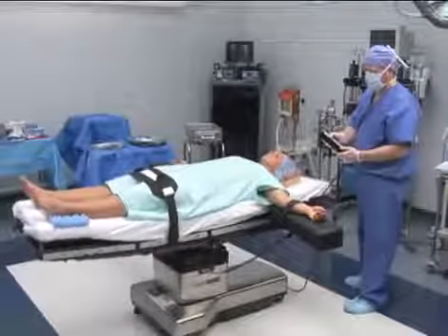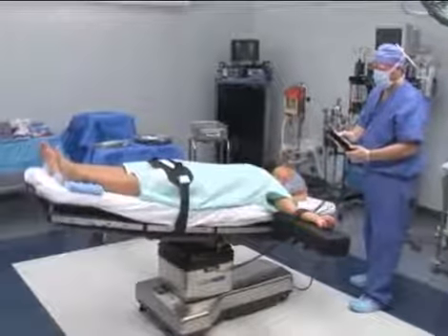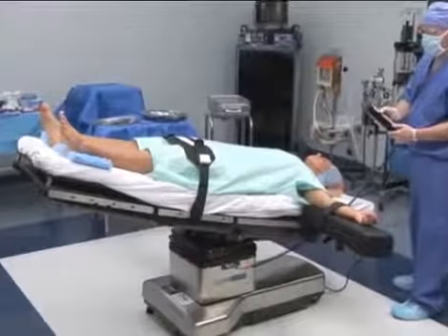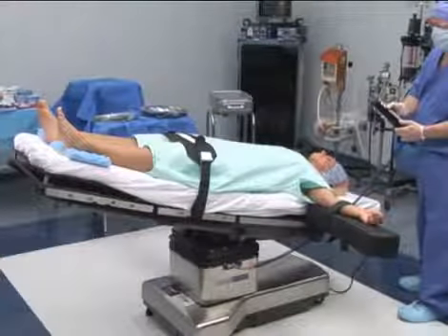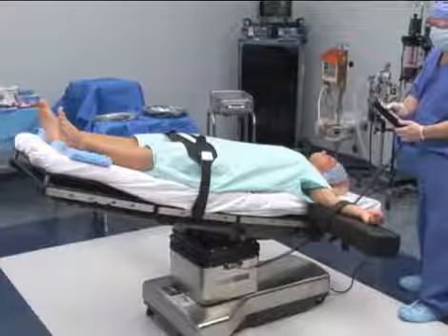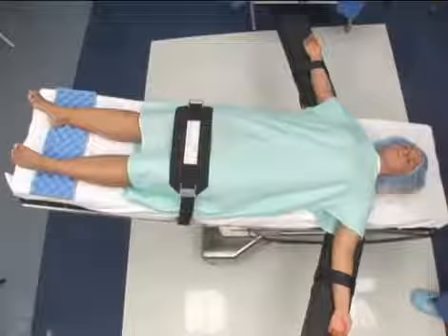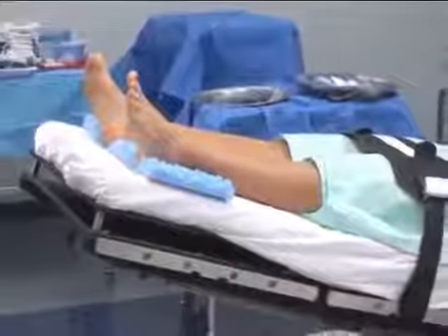The Trendelenburg position is a variation of the supine position in which the operating table is tilted head down. This position allows greater access to the lower abdominal cavity and pelvic structures by allowing gravity to retract organs such as the small intestine, proximal large bowel, and omentum toward the head. The position is commonly used during lower gastrointestinal surgery and pelvic surgery.